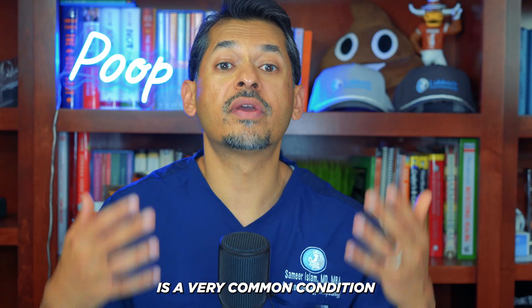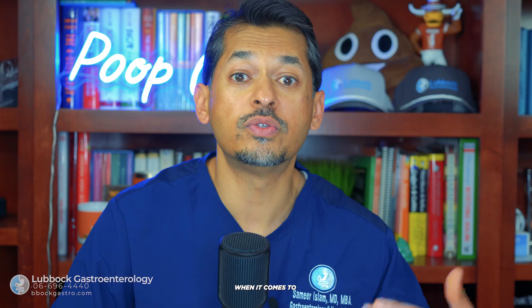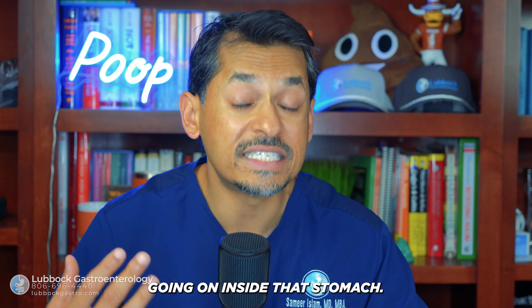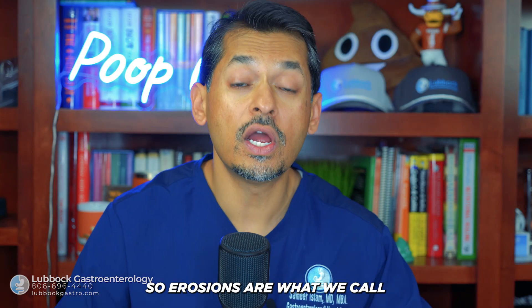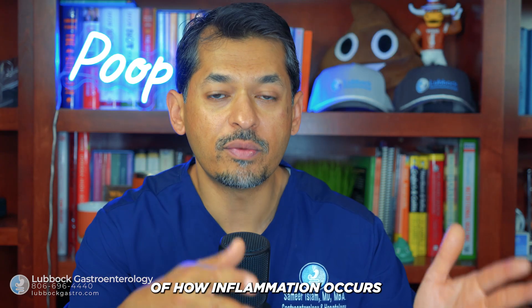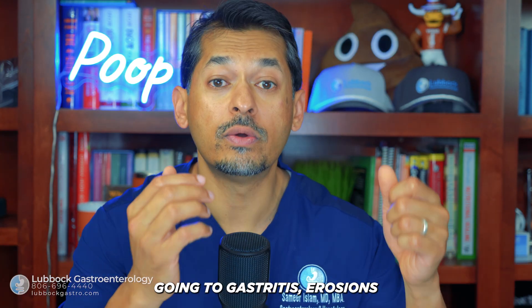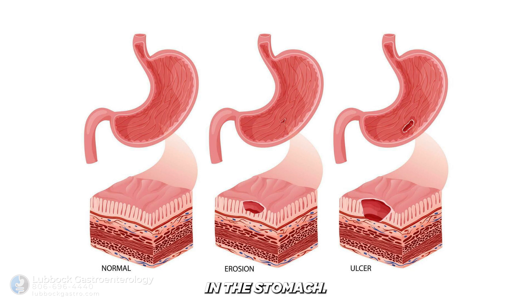Gastric erosion is a very common condition that I see in the GI tract. A lot of people suffer from issues when it comes to gastric erosions or inflammation going on inside the stomach. Erosions are what we call pre-ulcers inside the stomach. There's a wide spectrum of how inflammation occurs within the stomach, starting off with a normal stomach, going to gastritis, erosions, and eventually what's called an ulcer in the stomach.